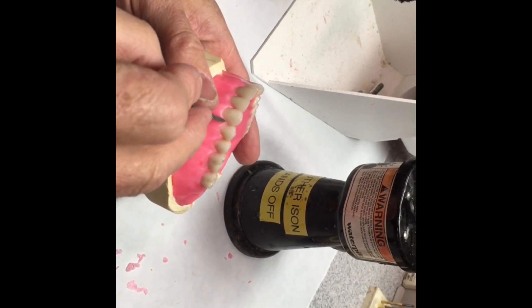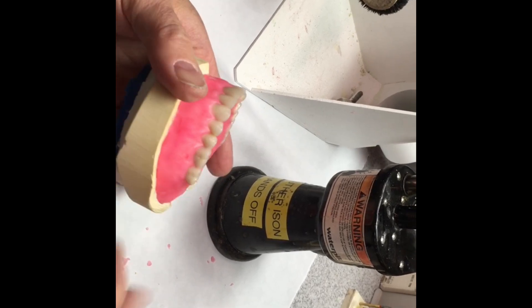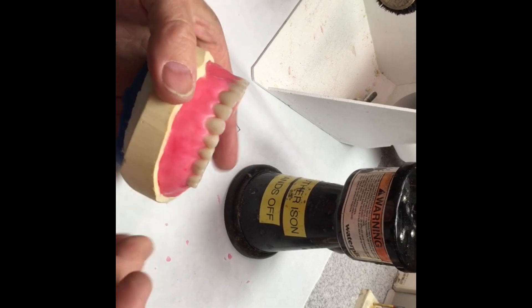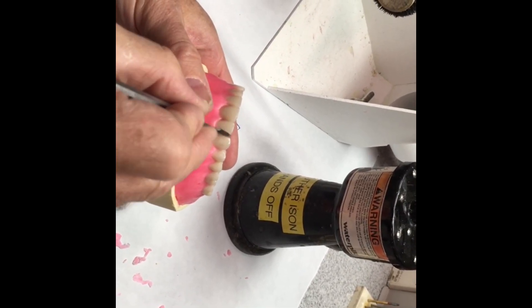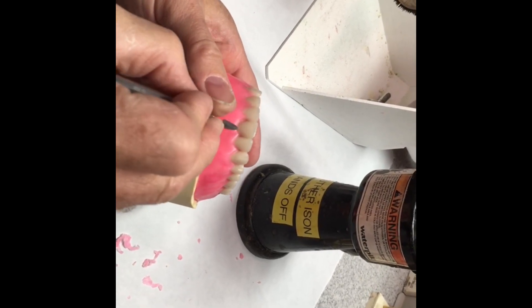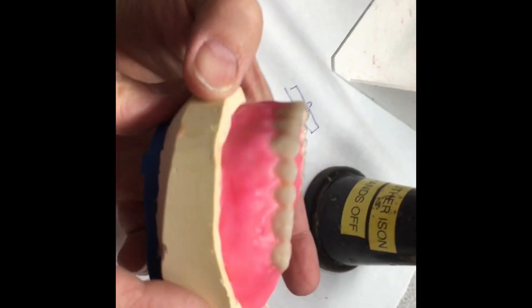Lastly, if you want to hit it with a number 11 standard stiff Robinson denture brush to take any last film of wax off the teeth, you can do that. Just go real slow and gentle so it doesn't cut into the tooth. It'll look something like that, and you can continue doing that all the way around.